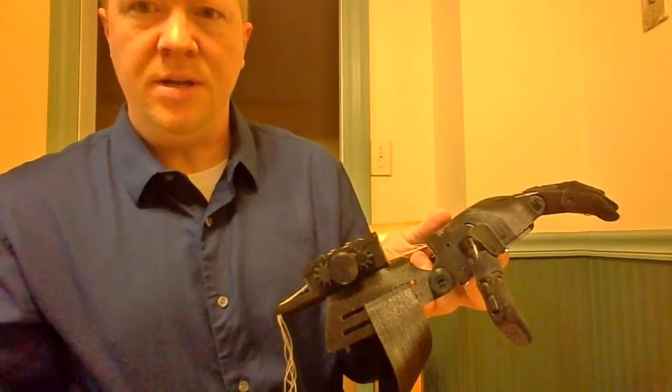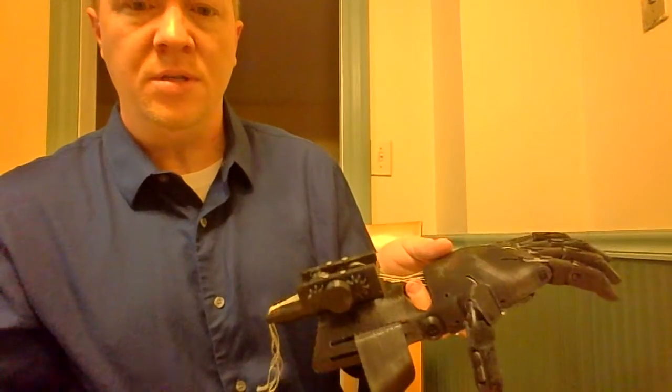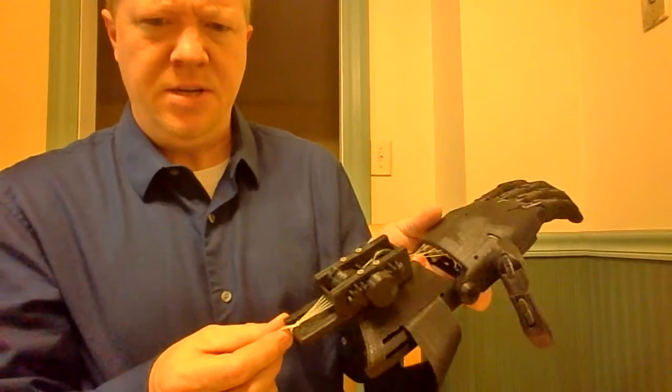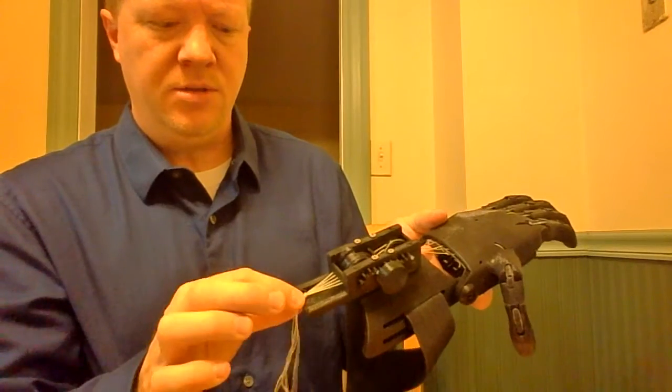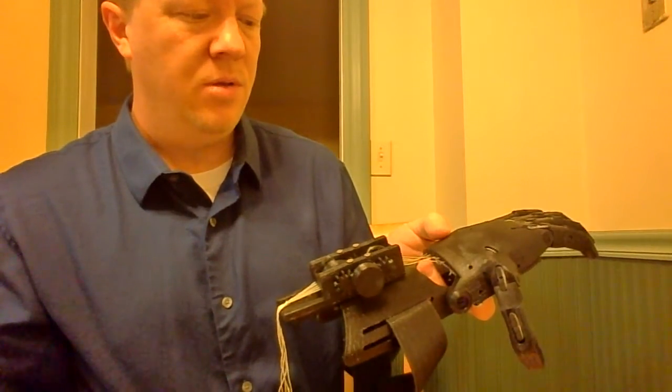I've got plenty more designs to come up with, but anyway, I want to post this as version 2 to see what everyone thinks of that. I still need to come up with a tensioner. All I've got is the strings tied in the back. I need to come up with a smaller tensioner for that, which I'll be doing soon as well.